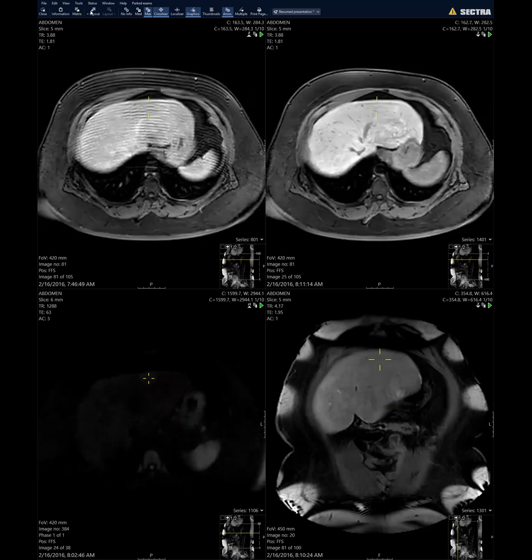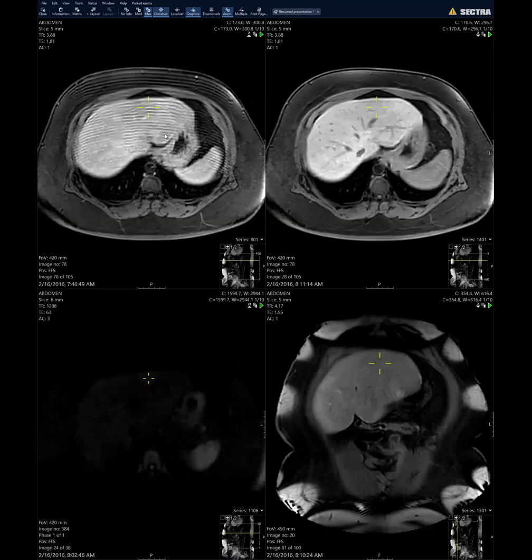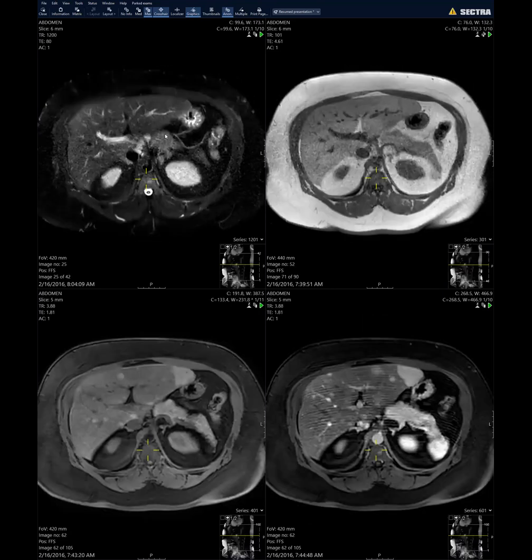Yeah, so that's the confusion that we always have with these cases when the background liver is so fatty and we have these middle-aged or younger females who have this diffuse hepatic steatosis and you have these multiple lesions. We sometimes get confused whether we are just looking at focal fatty infiltration or multiple hepatic adenomatosis.